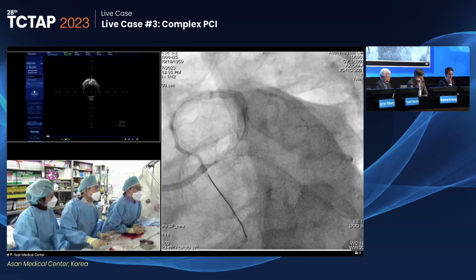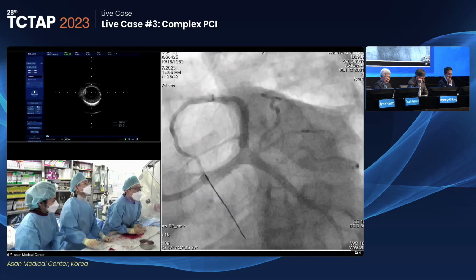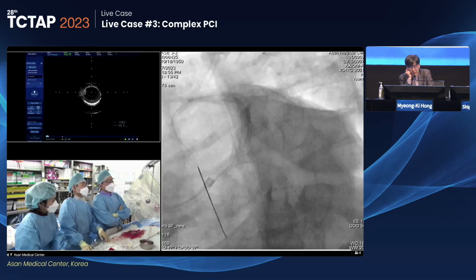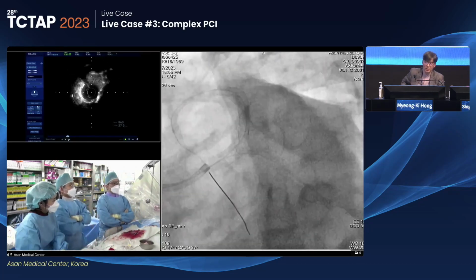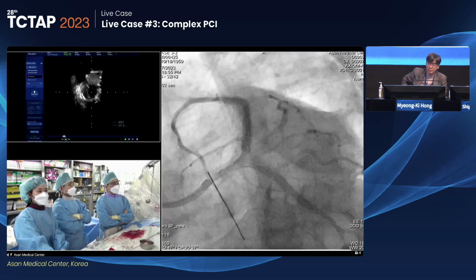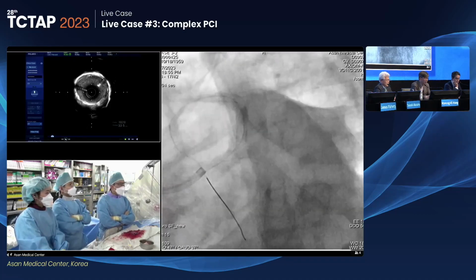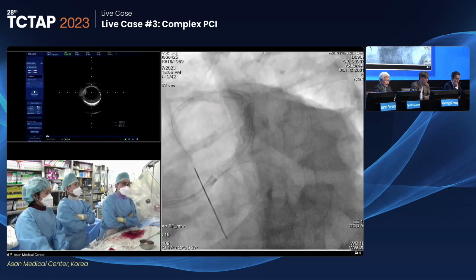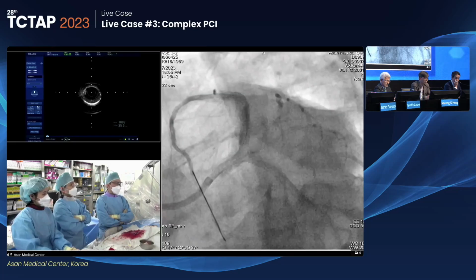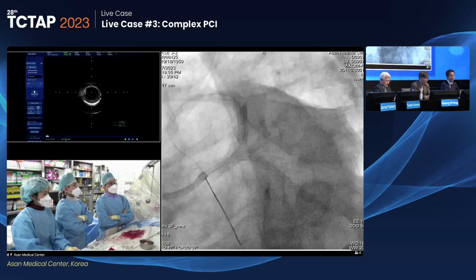And definitely there is some hematoma. The hematoma makes some haziness. Just leave the circumflex alone, and prescribe dual antiplatelet therapy for a longer time. You're right, you didn't really bring it back. It was more of a reverse T and protrusion than a true crush. But I think the stent position is fine. It's simpler. A little bit different from what I intended at first, but the stent position is good. There's a hematoma, and the lumen is okay.